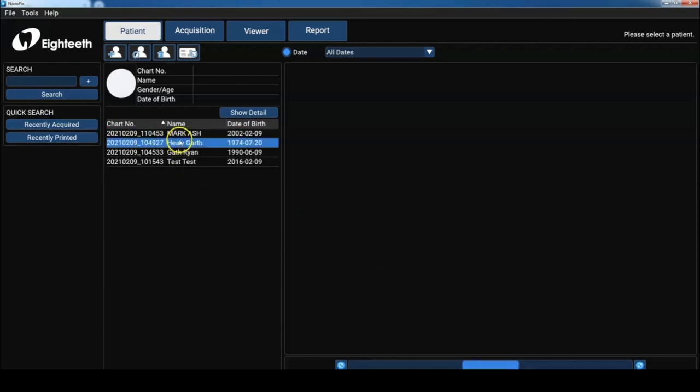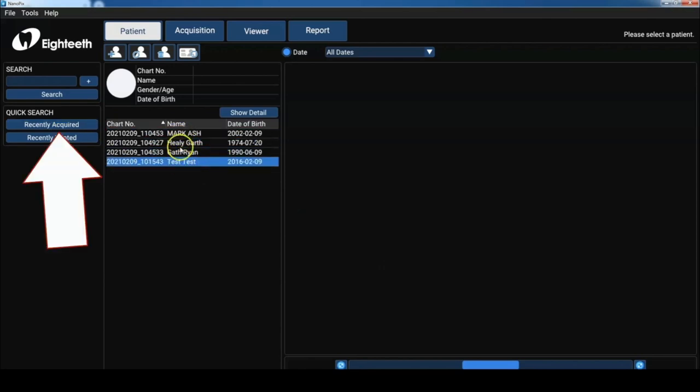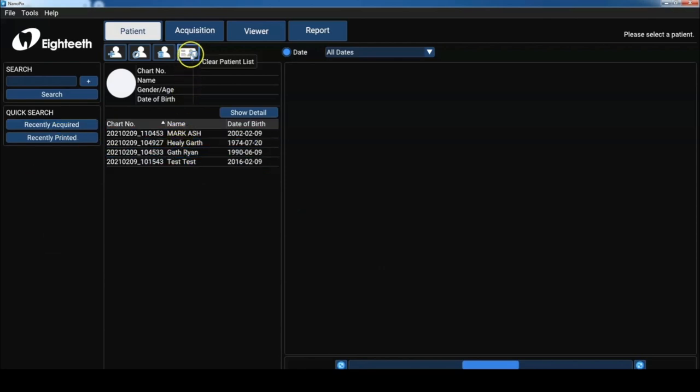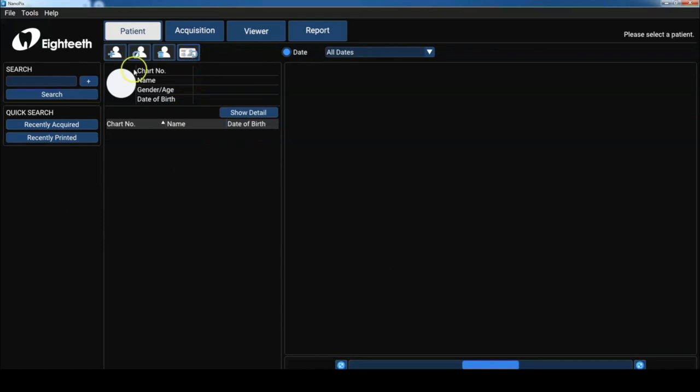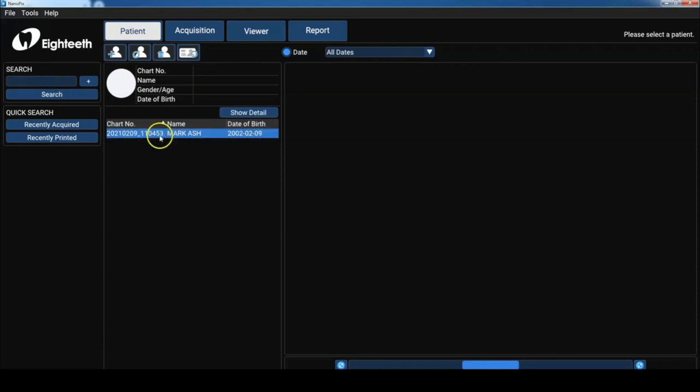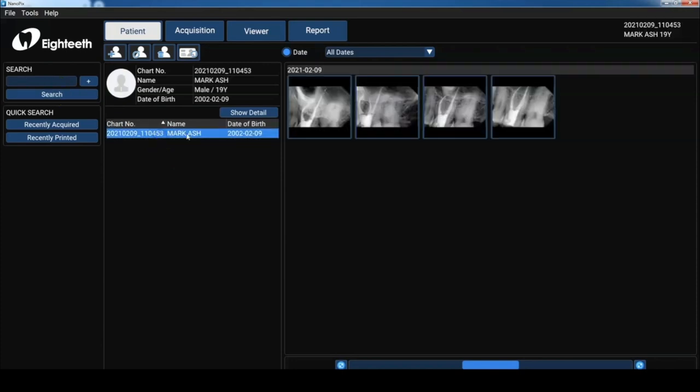I love the ability to use the recently acquired button to quickly search for any x-rays that have been taken within the past three days. But you can also be more specific and enter the patient's name into the search bar. And there we are, my root canal.